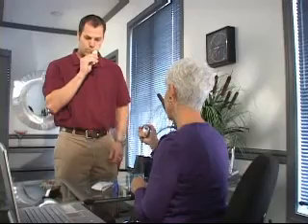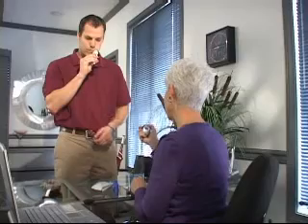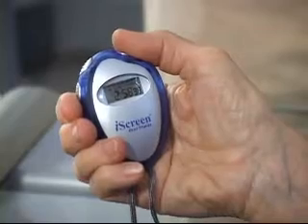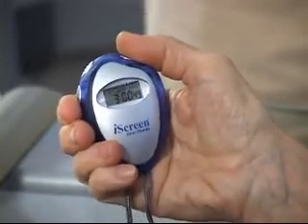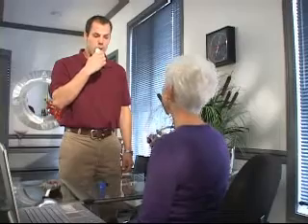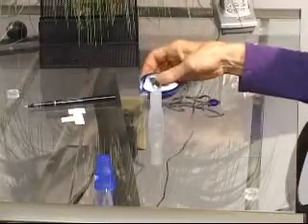Next, instruct the donor to actively swab the inside of the mouth and gum areas for 3 minutes. During the swabbing process, the donor will notice a softening of the swab as it collects oral fluid. The donor may stop swabbing after 3 minutes or when the swab has become completely soft and saturated.